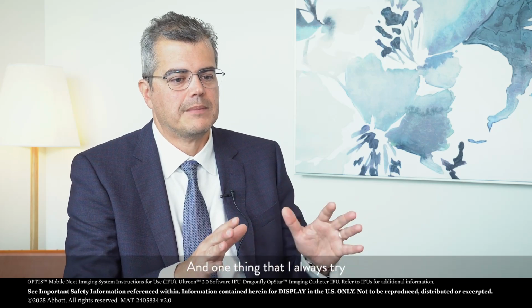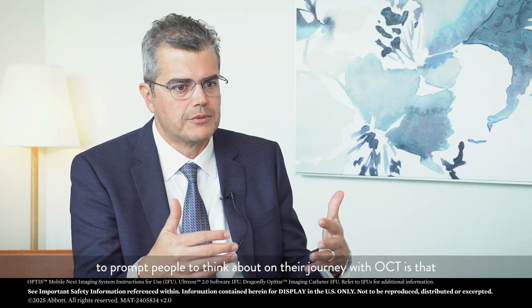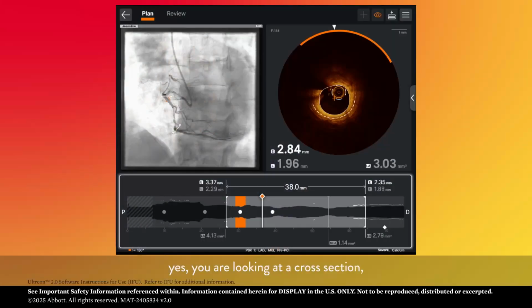And one thing that I'm always trying to prompt people to think about on their journey with OCT is that yes, you are looking at a cross section, but you should deal with the entirety of the pullback, on what we call the L mode, and you have a perfect segmentation of the lumen for free. You don't need to manually draw the lumen as you used to do on IVUS.